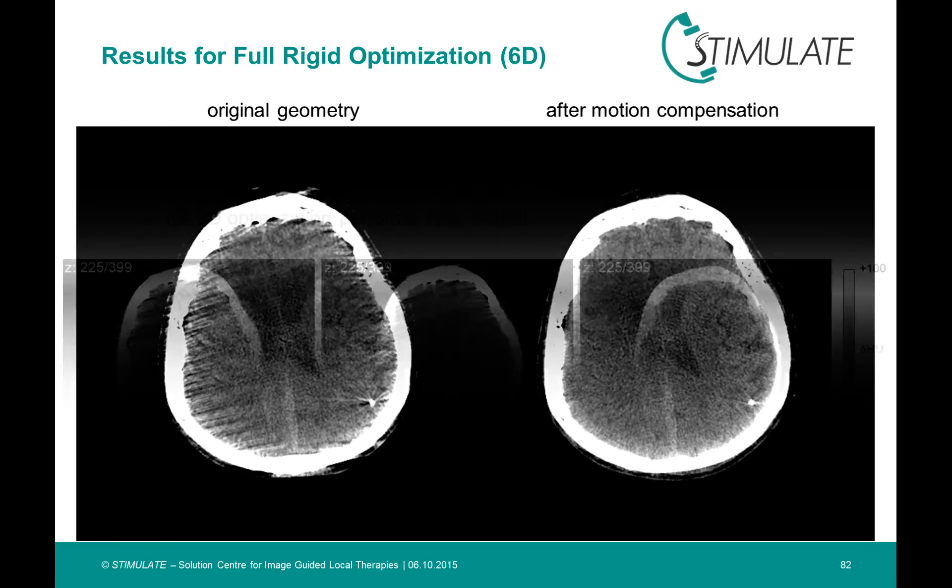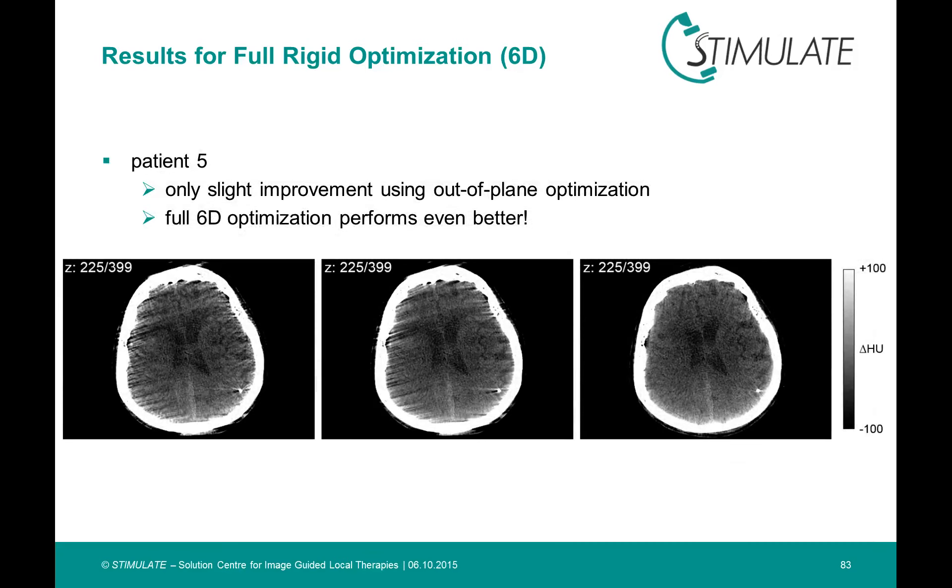This is the comparison of the original geometry left. In the middle the reconstruction after an out of plane optimization. And finally on the right the correction of the full 6D parameter vector including the in-plane parameters.